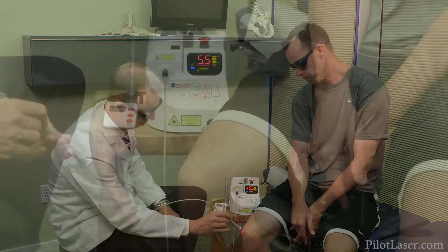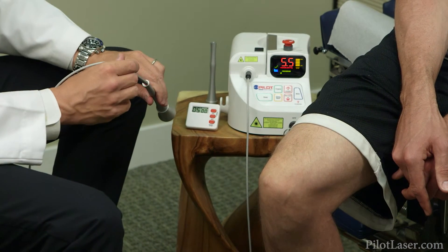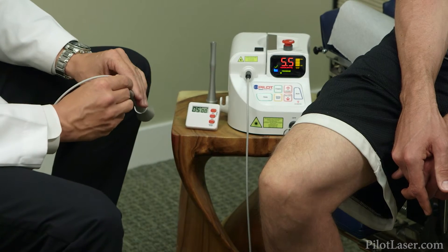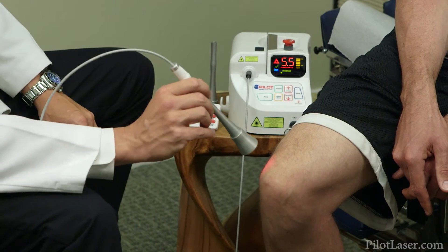Additionally, the thickness of fatty tissues under our skin can interfere with the effectiveness of the treatment. In those cases, you'll have to make adjustments such as adjusting the wattage to a higher level or moving more slowly over those areas.